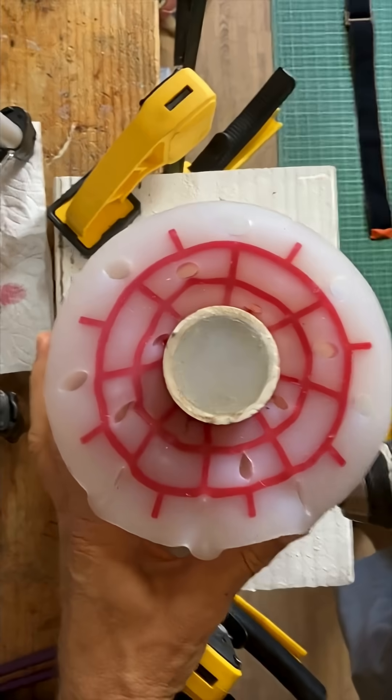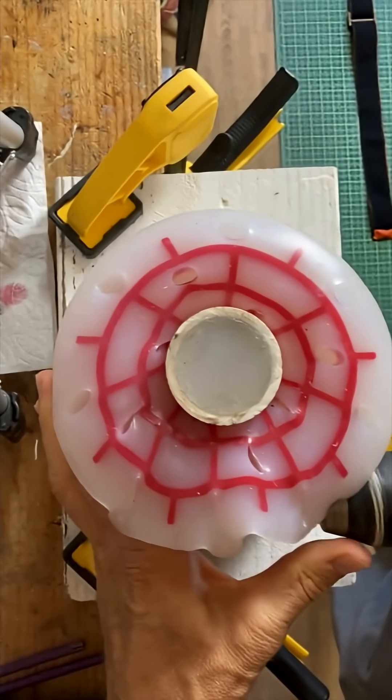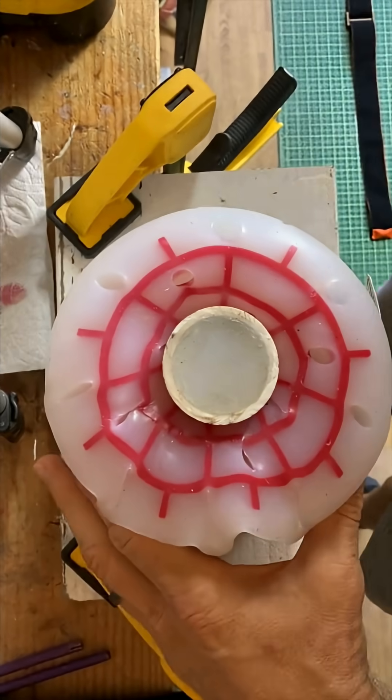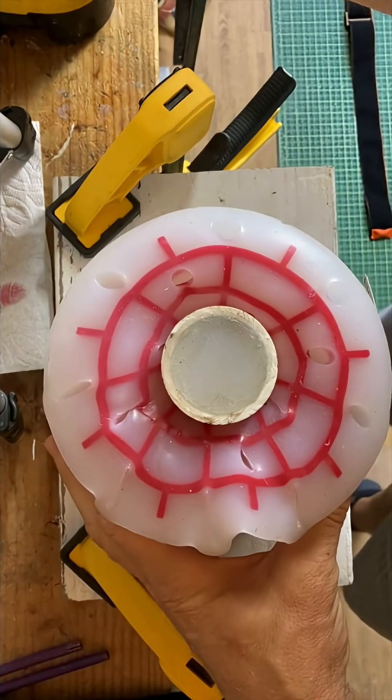Go a little bit more. All right, that's completely closed off. The moral of the story is the depth of the arteries matters. Also, where you put the constriction mechanism matters — one thing I can control, the other thing that's harder.